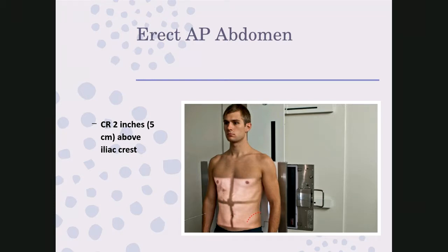Ideally, if they drove to the facility and they sat in the waiting room, then they've already accomplished that, being upright for at least 5 minutes, which would be good because all the air would rise and all the fluid would fall. Technique on this is still 80 kVp at 12.5 mAs.